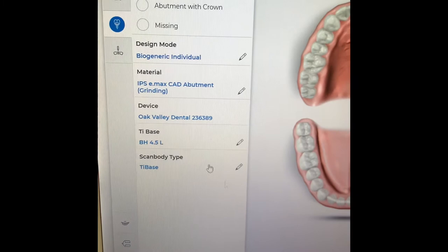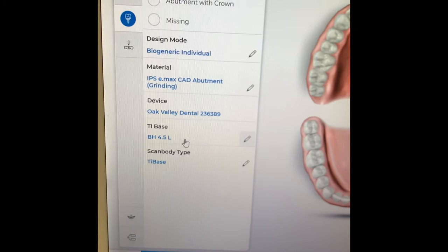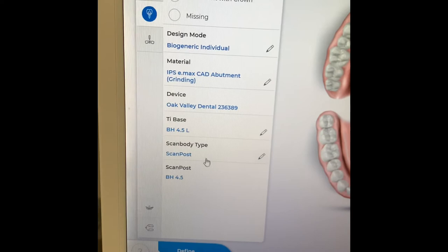So once you get to this screen, you're going to select an implant screw retain crown. We're going to do biogeneric individual — that's just the way I like to do it. And then we're going to select Emacs, and then under the tie base, you're just going to select the appropriate one, which in this case is going to be a BioHorizons BH45L. We're actually going to try and use that as the scan body type. If it doesn't fit in there, then we're just going to change it to scan post.